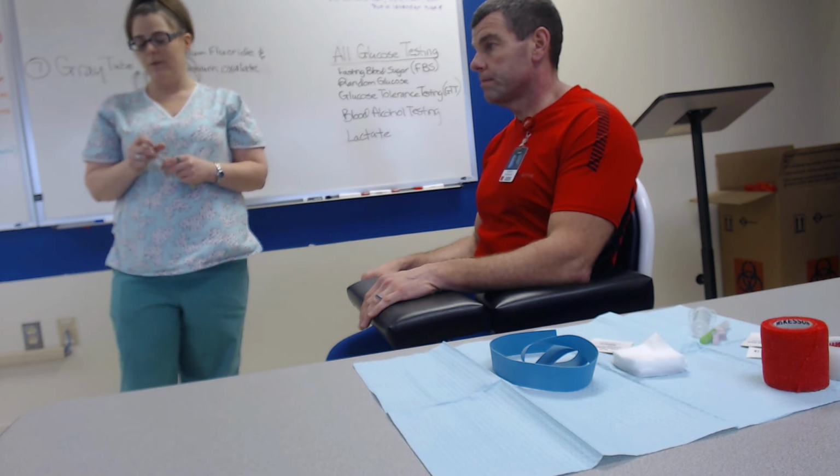And then you want to check your requisition again, make sure that you get the right tube. So when we're looking at that, we have a complete metabolic panel. That one is going to go into your gold tube. You have a lipid panel, which is also going to go into your gold tube, a complete blood count, which we'll put into our lavender tube, and then a fasting glucose, which will go into our gray tube.